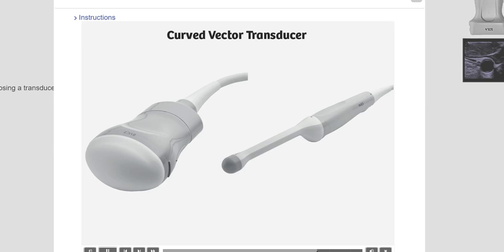Curved vector transducer. For obstetrics and gynecology applications, there are external and transvaginal transducers that create real-time full-volume data sets. Dissecting or rendering through the planes within the volume will reveal the structural anatomy of the uterus and fetal anatomy. Imaging near to the anatomy is the benefit of all intracavity transducers. Two-dimensional endocavity transducers also have a curved vector FOV and are used for transrectal and transvaginal imaging applications. Transrectal applications include prostate applications and transvaginal for obstetric and gynecological applications.